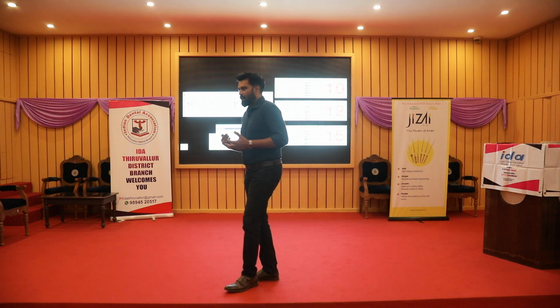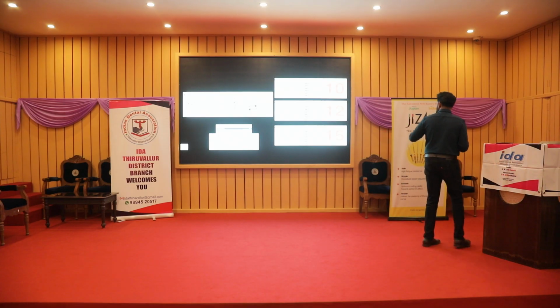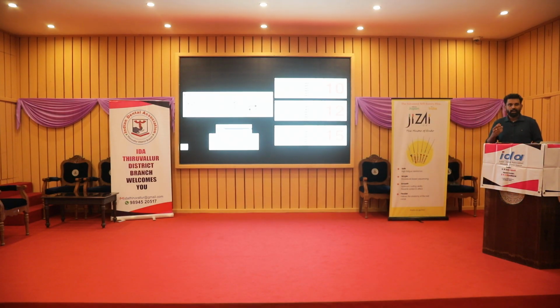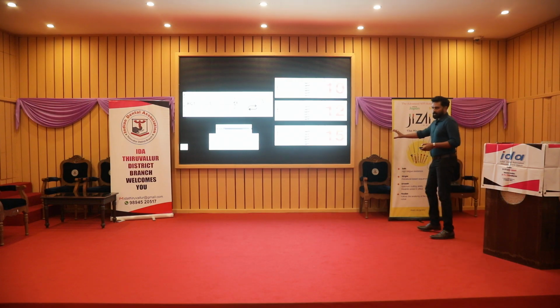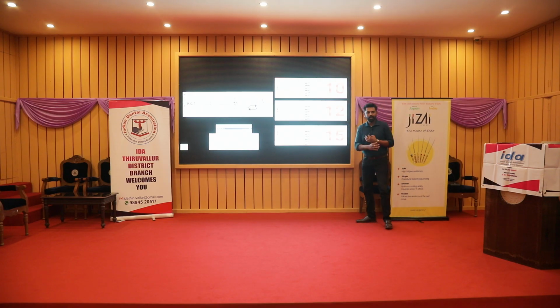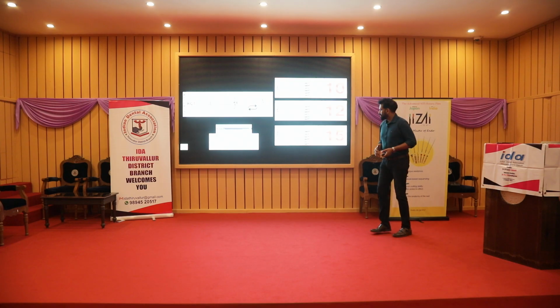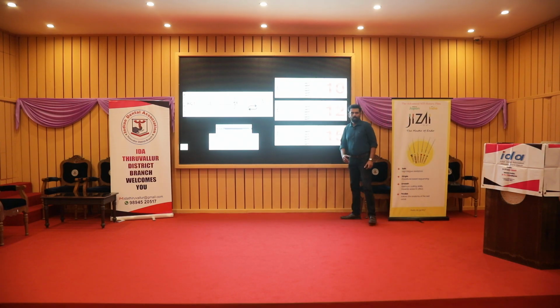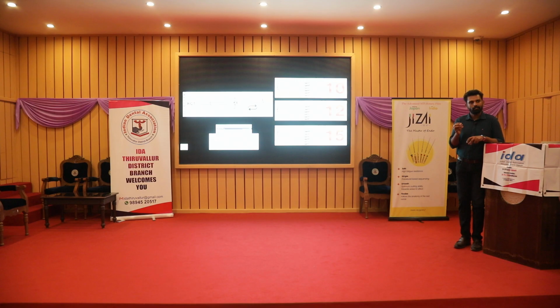Over a period of time, as we acquire a lot of knowledge, according to this particular journal, they have shown that for anterior teeth, around 10 minutes of irrigation is necessary. For a premolar, it needs around 12 minutes of irrigation, and a molar should have a minimum of 15 minutes of irrigation. That doesn't mean you have to irrigate continuously for 15 minutes. From start to end, at least 15 minutes of irrigation is necessary for a good, predictable result. So irrigation itself will take this much time. You cannot complete a root canal within 20 minutes.